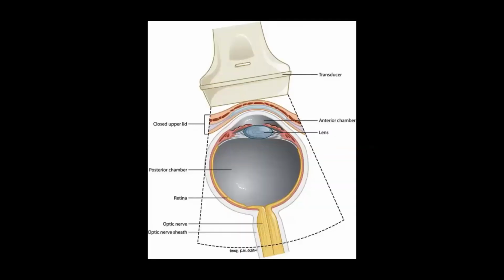And then when you do this study, the transducer can be placed in a number of different places. So if you're doing a full comprehensive B scan in the ophthalmology office with their specialized little transducer, they're going to be doing circumferential views directly on the sclera around the limbus, right? And they orient it in the horizontal and the vertical planes to look at different parts of the eye. And then they also have the axial or just the mid-corneal view, right? You can do that in the sagittal or the transverse orientation.